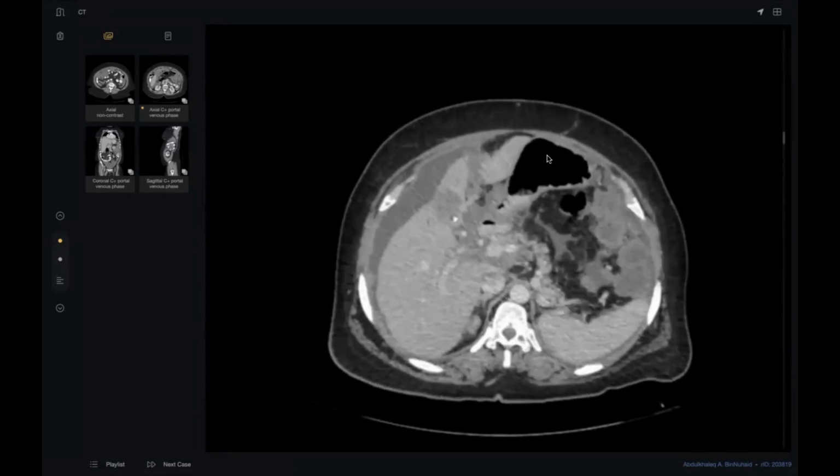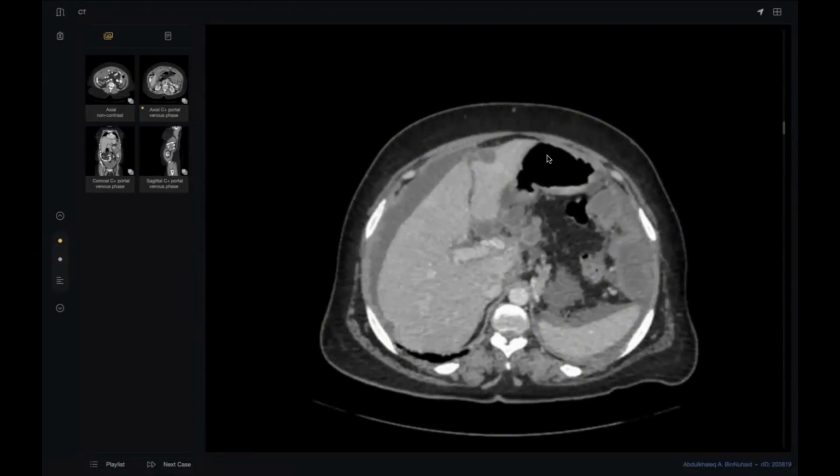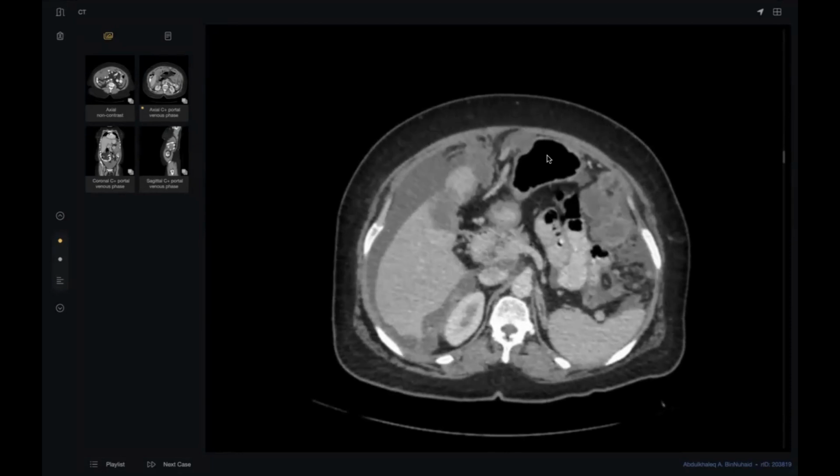What's your diagnosis? There are multiple cystic lesions in the liver. There is intraperitoneal metastasis of unknown primary. I will ask for tumor markers and histology and cytology. And look here, what happened to the liver surface, please.